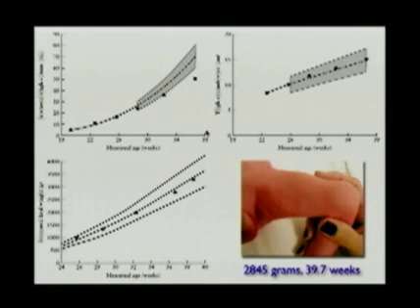This is just one example of a fetus that was growth restricted at term, and you can see 3 graphs here, one showing fractional thigh volume, one on the right showing thigh circumference, and estimated fetal weight. Typically speaking, we would follow this baby using the estimated fetal weight graph, and you can see that that'd be in a normal range. But fractional thigh volume actually showed that there was evidence of growth restriction even as early as roughly 28, maybe 33 weeks here, and the thigh circumference, the traditional 2D parameter, also showed no problem.